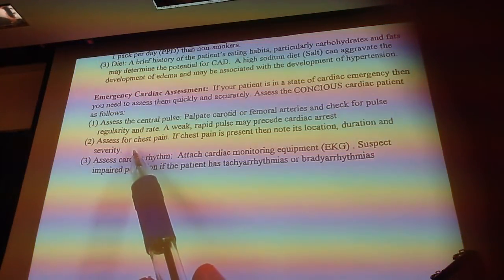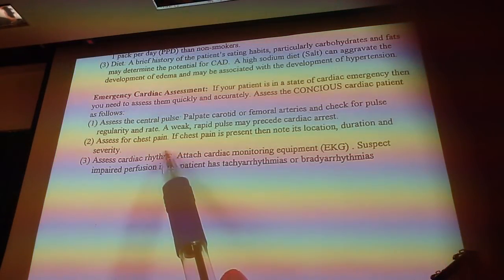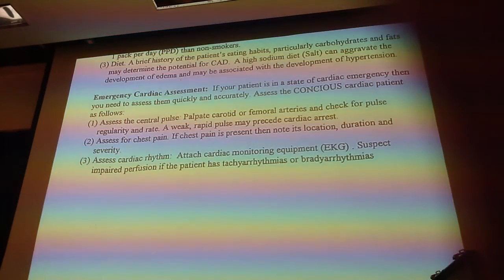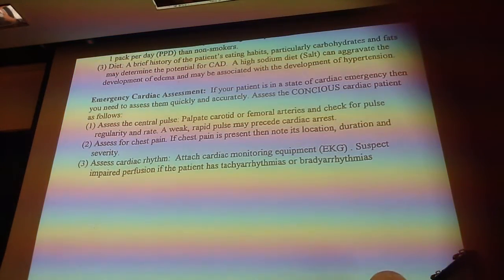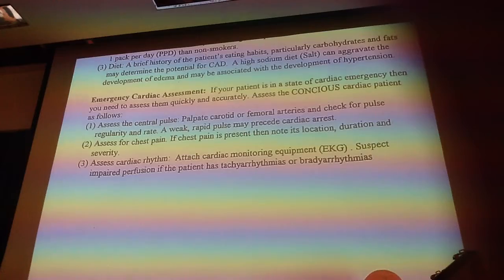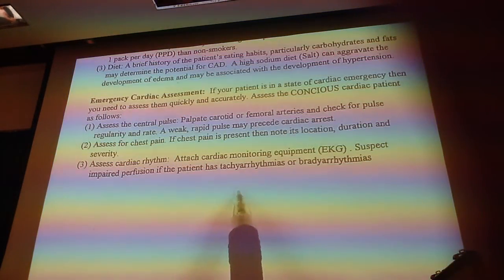The chest pain, as soon as they start complaining about chest pain, we better stop the study right now and get an EKG on them, get a pulse oximeter on them, and put them in a comfortable sitting position. It's easier for a person who's having cardiac problems to be in a sitting position.